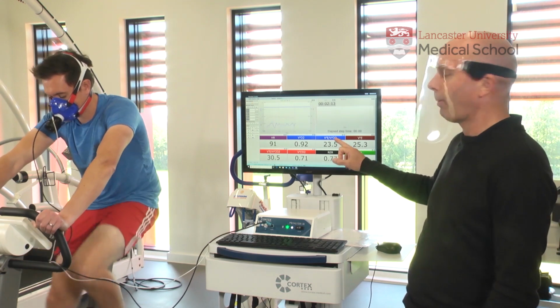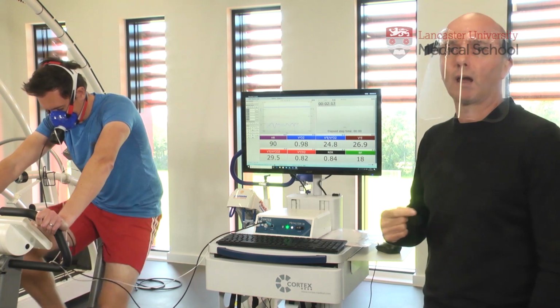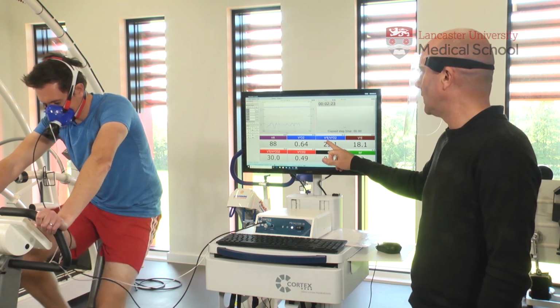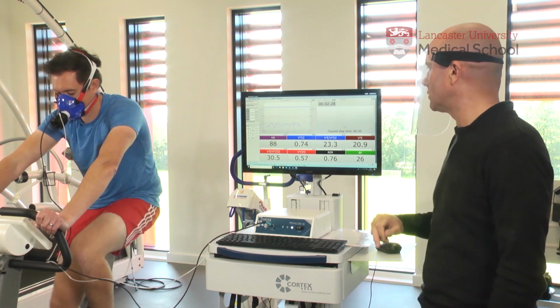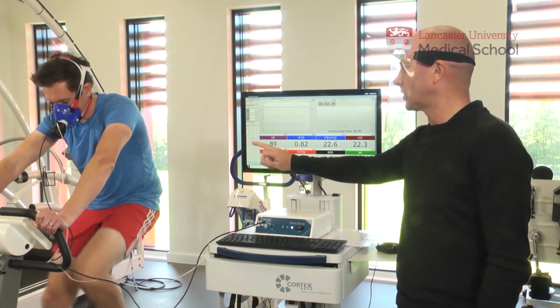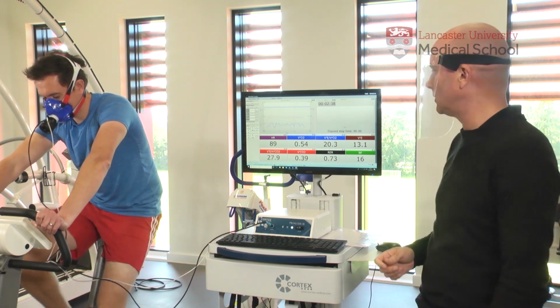We then have two important measurements that you'll need to use when you're going to work out the ventilatory thresholds. So we've got ventilatory equivalent for oxygen, which is the minute ventilation divided by the volume of oxygen consumed, and you've got the ventilatory equivalent for carbon dioxide there. And we'll probably ask you to plot those when you're looking at ventilatory thresholds in your second and third years.